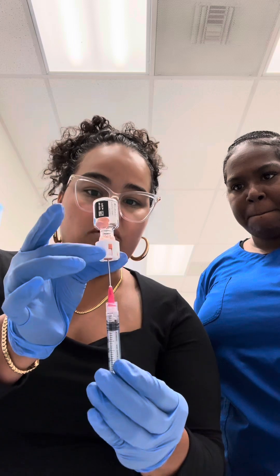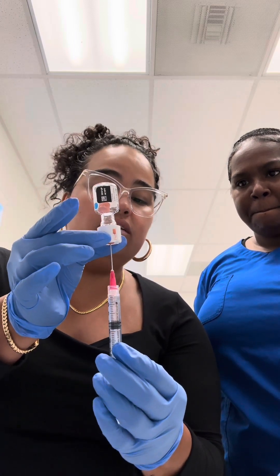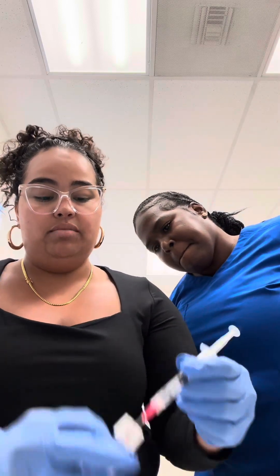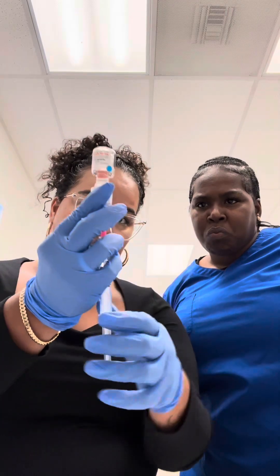Just watch your needle so you make sure you get all your meds, because that little stopper is in there. You should have your 1cc now. I already have medication in here, so no need to push more air — just push the needle in because we're getting the same thing. Bring it down because you have that little stopper right there.